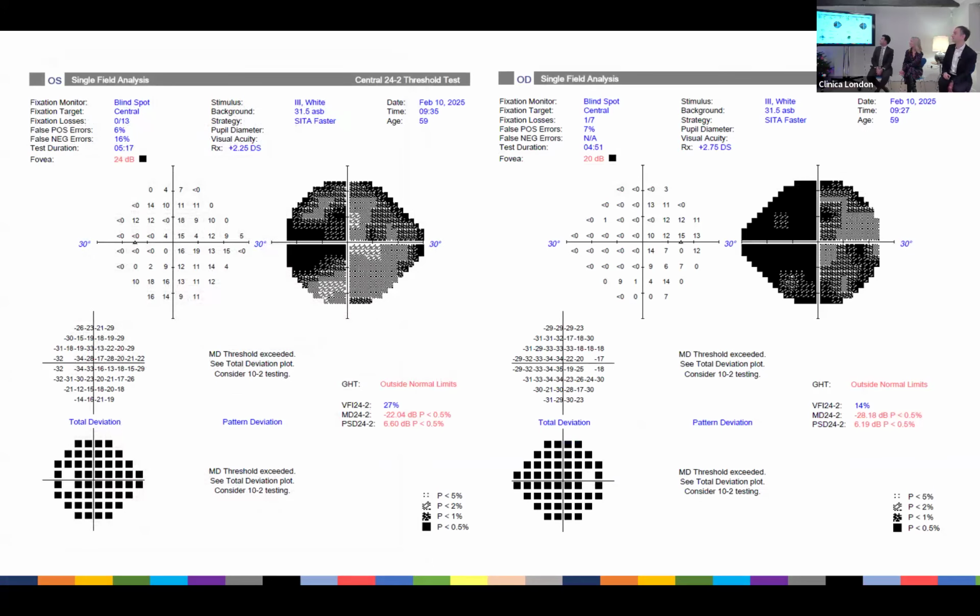Okay, so that was one case, pigment dispersion, and I've seen a trend now towards, I think as we've been getting better and better anterior segment OCTs, people have been more and more convinced that that's the right thing to do, to just totally reverse that reverse bowing. It's even without any symptoms, or the pressure being normal. Sorry, I'm just going to repeat the question.